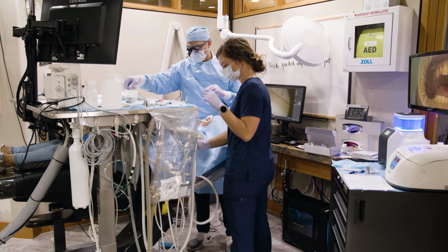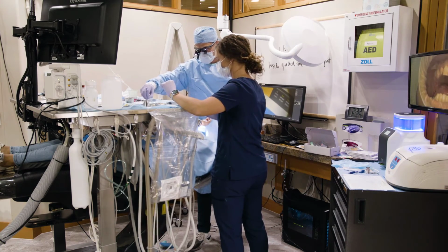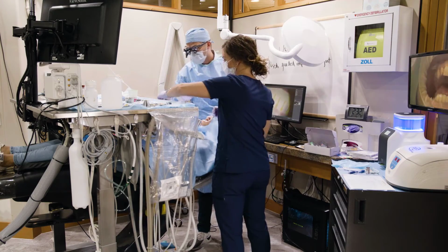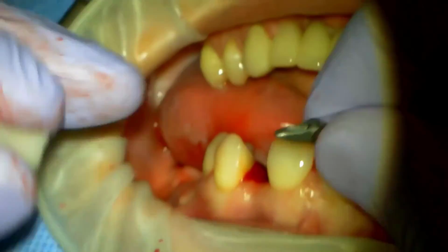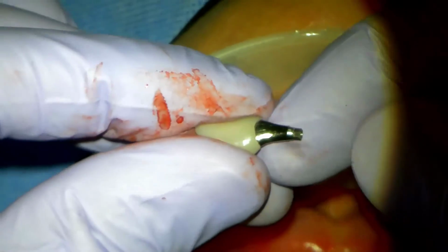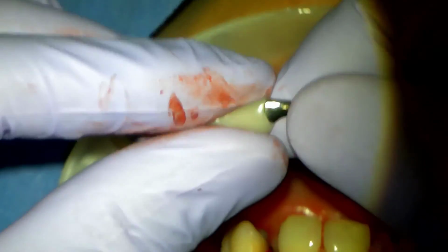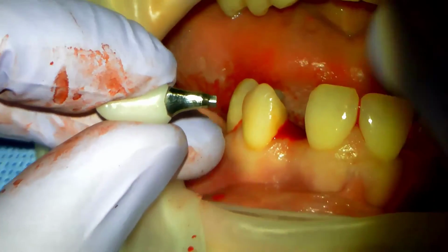All right, now we're going to take our custom abutment. So here's my custom abutment. Here is a temporary crown. You see the hex orientation there. We're going to do the best we can to suction some of the blood here.